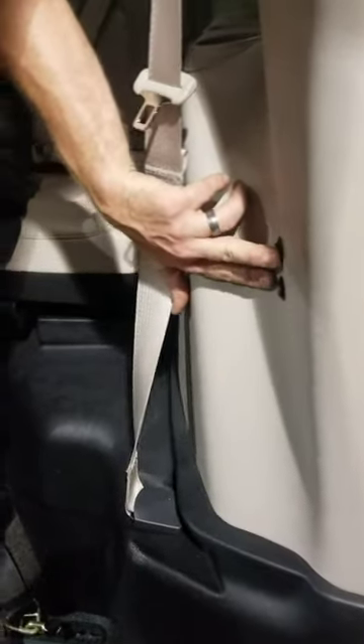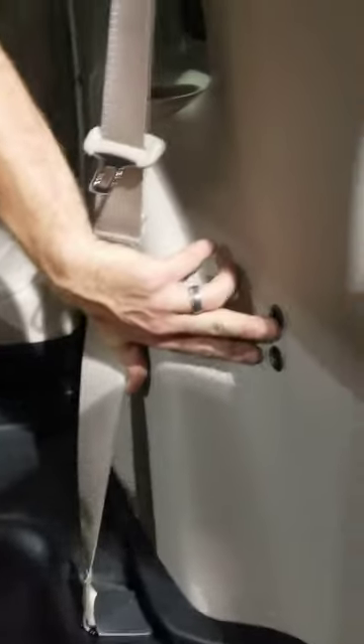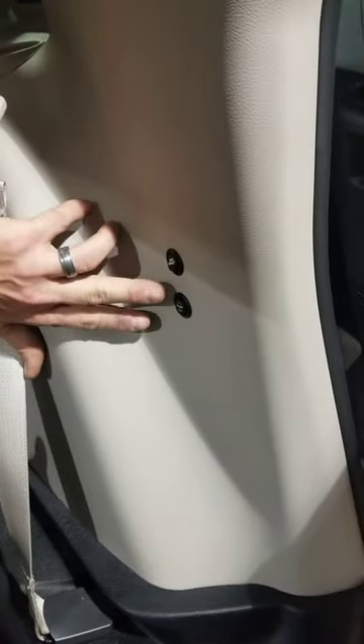You're going to hold this first button down. You're going to hear a beeping. Hold it down for about seven to ten seconds until the beeping turns from solid to alternating beeping.